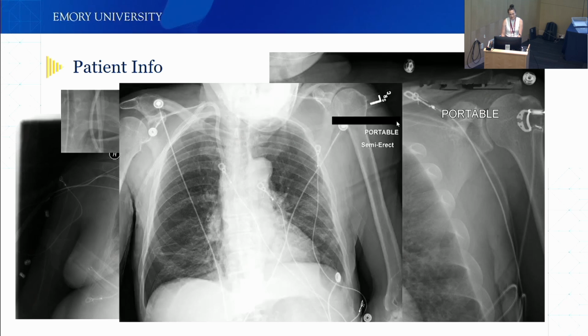We started with black boxes, but your AI algorithm just focuses on that. And then when you take images from another data set, for example the RSNA data set or the NIH chest X-ray data set, and they don't have that, it's very easy to say, hey, we take normal cases from the RSNA data set, disease cases of us, we had 100% accuracy. My students are great, they're not that great. So we're like, okay, it might be this box. You do a sanity check in between with a heat map, and yes, everything was focused on this box.